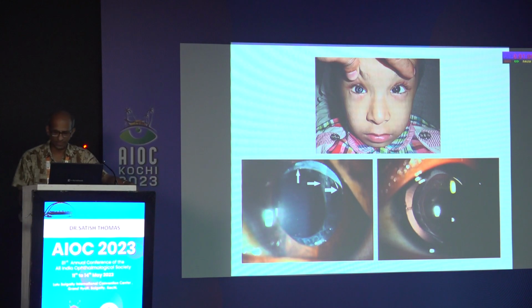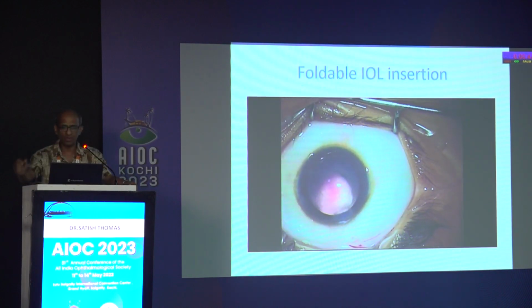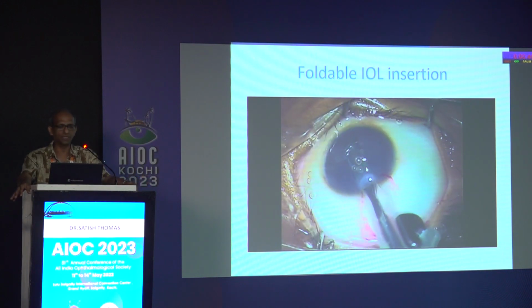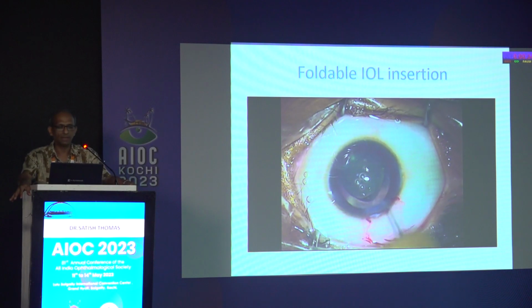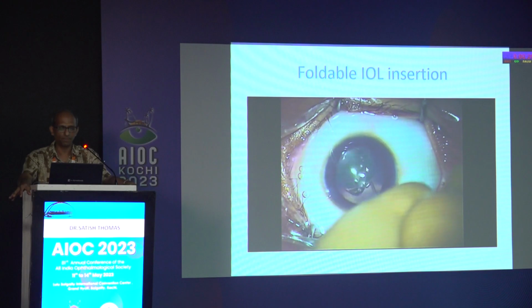So these are just photographs to show that opacification is invariable and quick immediately post-op, but if you've taken care of it in your primary surgery well, the visual axis continues to remain clear. An IOL insertion into a bag that's already open posteriorly needs care, can be a little tricky. Just make sure that your leading haptic goes into the bag fornix, and then you can direct the haptics into the bag carefully.